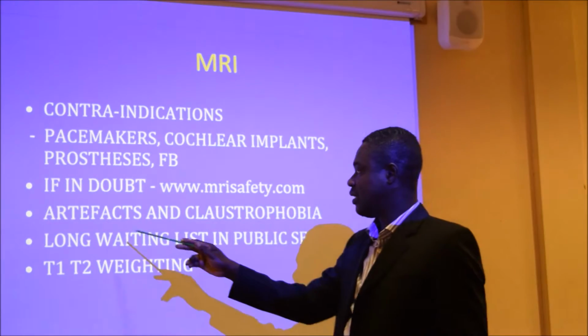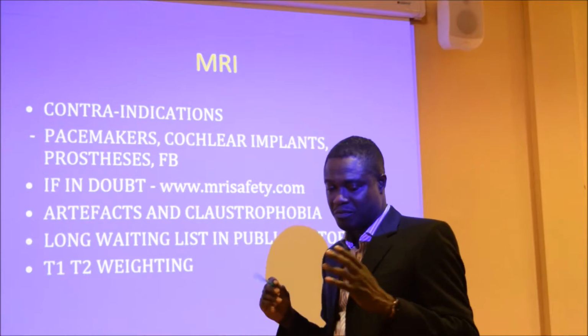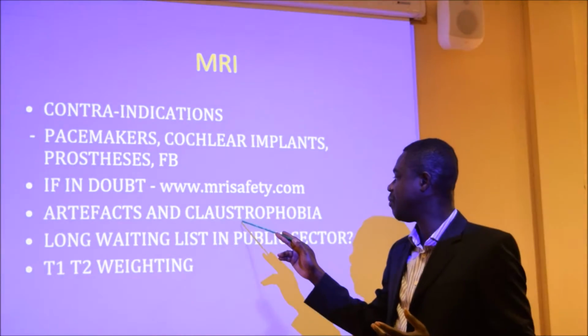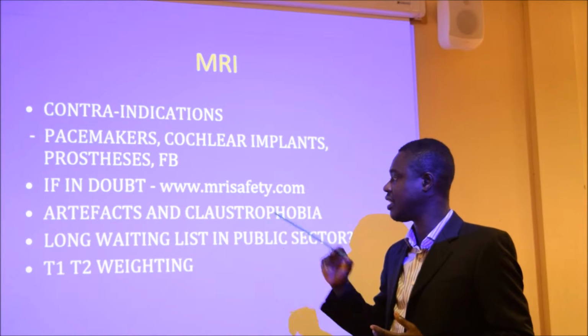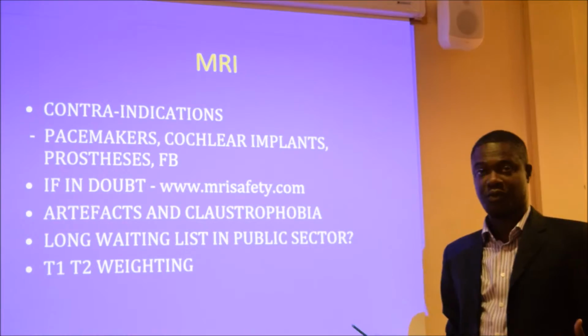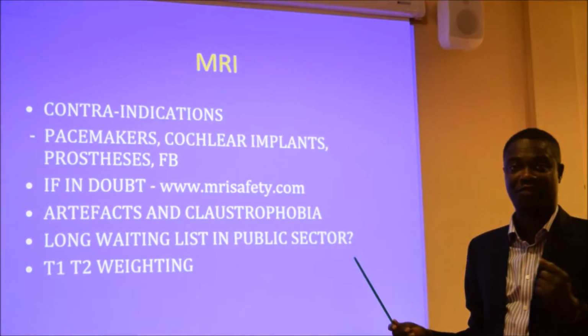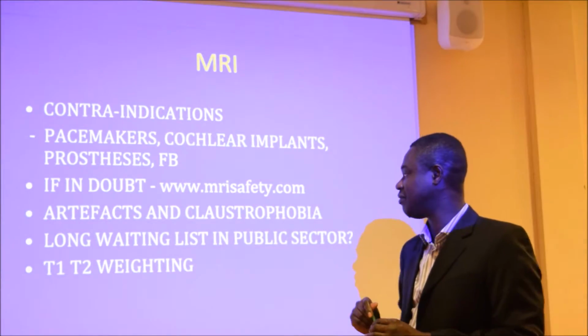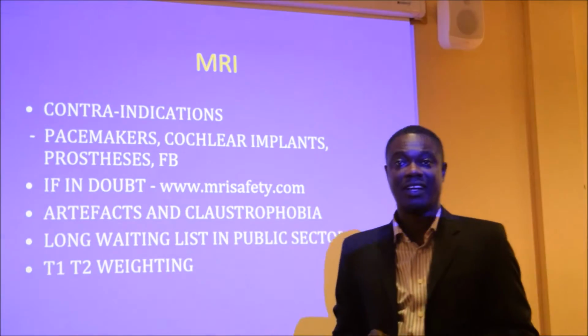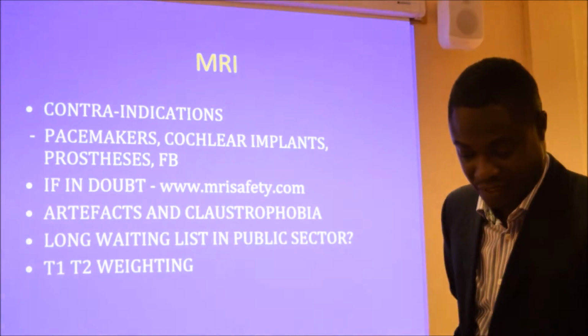The other problems with MRI is that because not many people like being in an enclosed space, you may have patients who cannot tolerate an MRI scan because of claustrophobia. And then when you are in an enclosed space for too long, you tend to move. And if you move, you're going to develop artifacts. Long waiting lists in the public sector. And the cost, obviously.